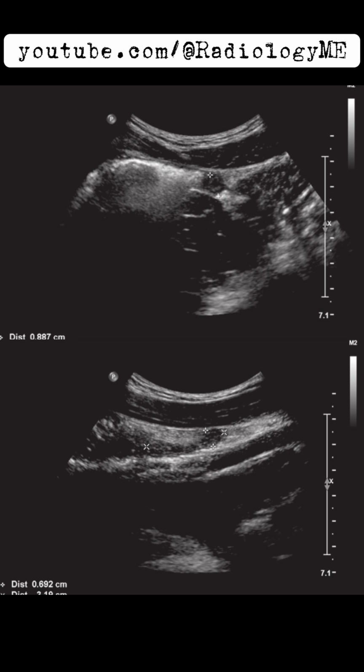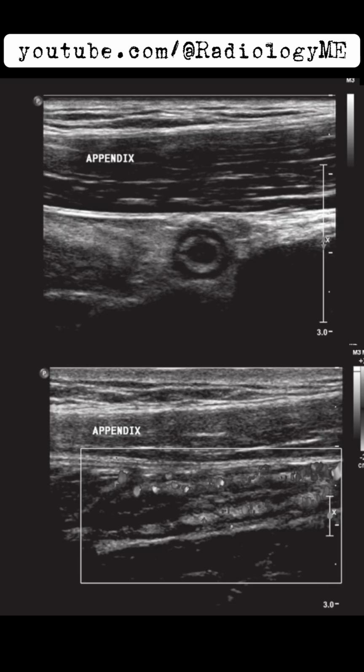However, to further strengthen this suspicion, the use of a high-frequency linear probe would be appropriate to obtain even more detailed imaging of the appendix walls and surrounding fat. Hypervascularity, if present, can be confirmed with Doppler ultrasound, which further indicates inflammation.